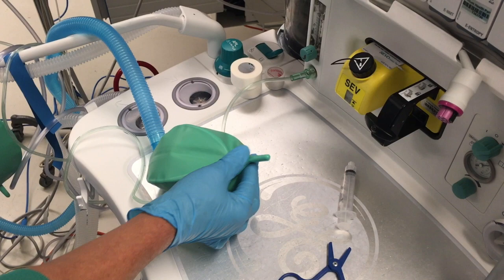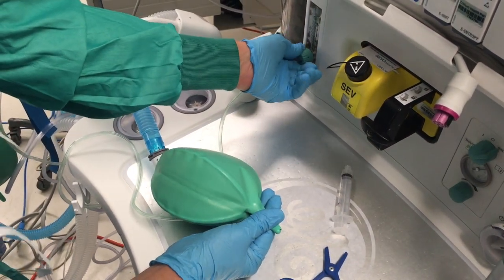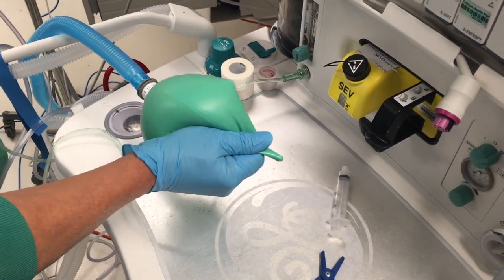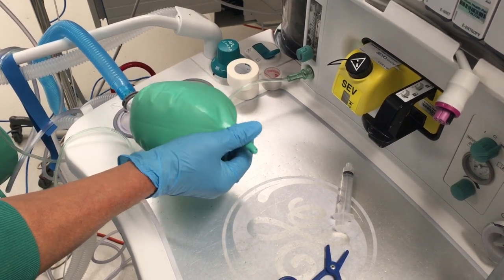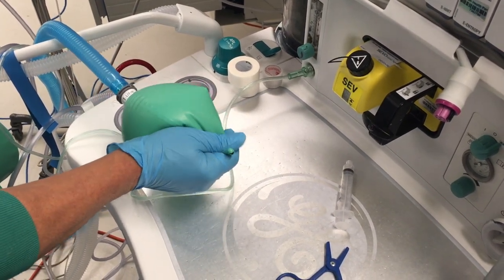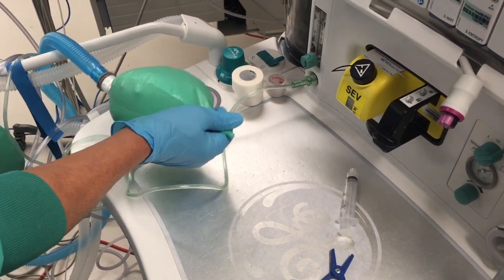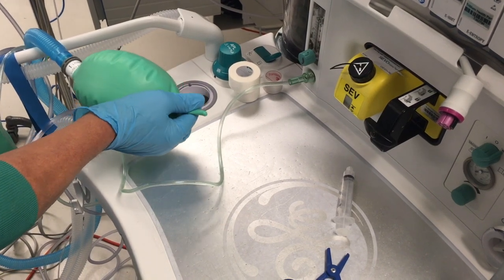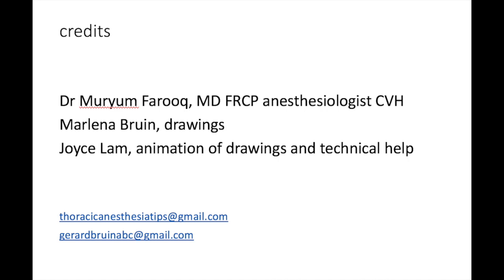Here I'm using the alternative technique, which I usually do when I'm trying to flush nitrogen out of the lung, for example, while preparing for one lung ventilation. I just simply squeeze the bag, use my hand, and I'm probably reaching a peak pressure, just looking at the bag there, of about 25 centimeters of water. We have an option for connecting a separate pressure manometer, but we tend not to use it. It seems to be a distraction, but I'm not against it.